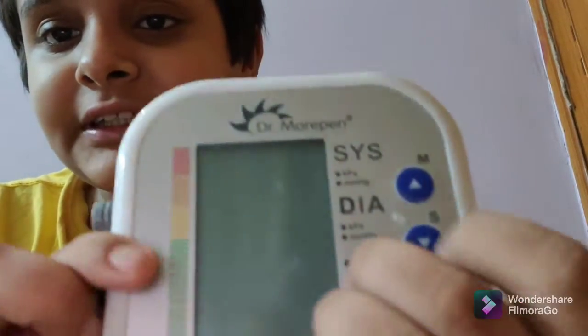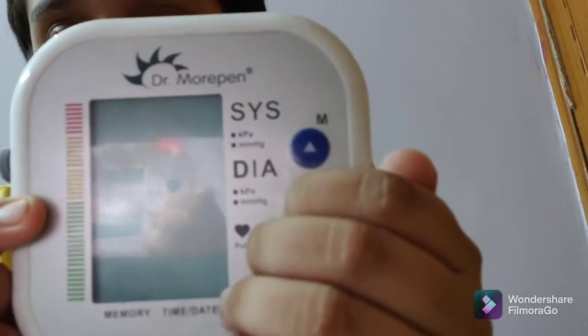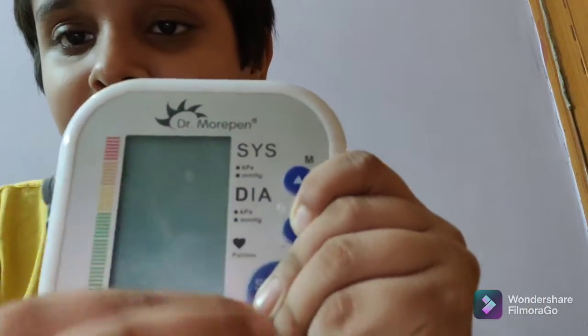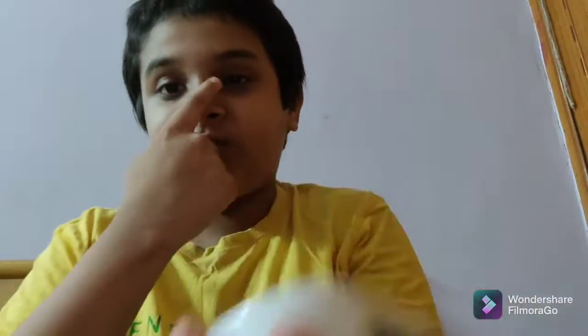Without wasting any time, let's get started. Coming on to the build quality and design — it is made in a square shape. On the front we get a five-inch display screen, which is the screen we will see on this BP machine. You will also get the start and stop button. When you wrap this around your hand, tie it tightly and press the start button, it will begin monitoring your blood pressure.